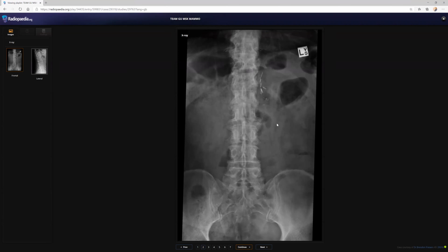So what will you do? I would further look for what kind of surgery the patient has undergone, and whether there is any obvious clinical history from the patient. With the findings you have given so far, what surgery might it have been? Most likely renal surgery, nephrectomy. Yes, you got the correct points. So maybe renal cell carcinoma. Definitely, I would be looking for some osteolytic metastasis in this case.